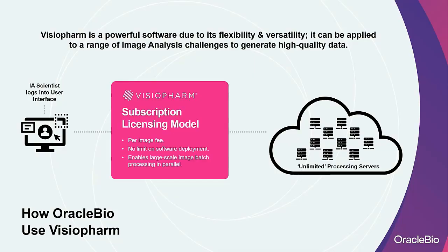The case studies we'll talk about next have thoroughly benefited from this subscription model due to the massively parallel processing powers we can achieve with the IT infrastructure that's in place for high throughput analyses. And I'll now hand you over to OracleBio's R&D project manager, Gabrielle, who will talk you through our first case study on a pathologist-validated image analysis workflow.